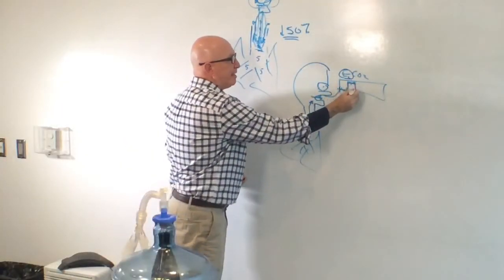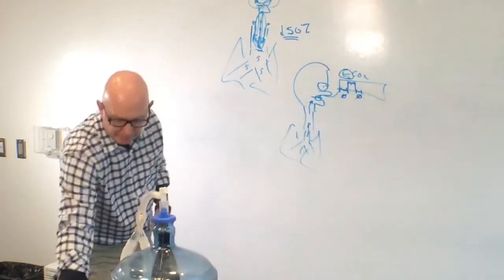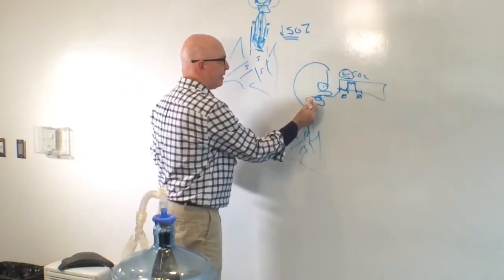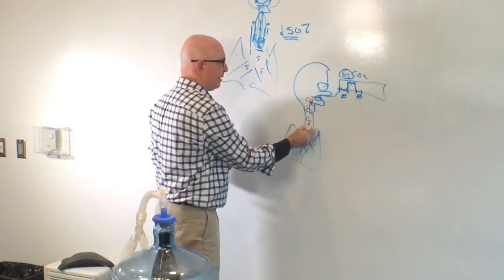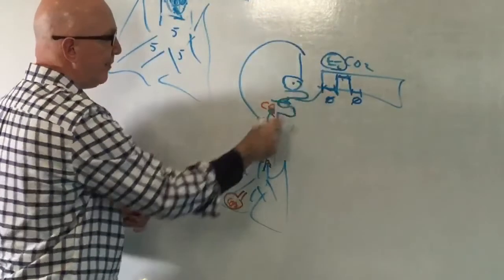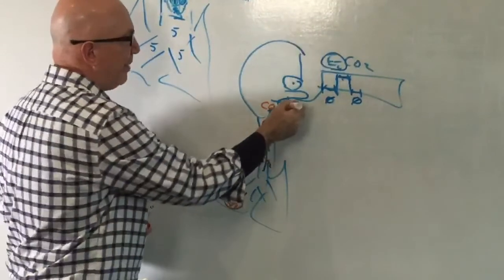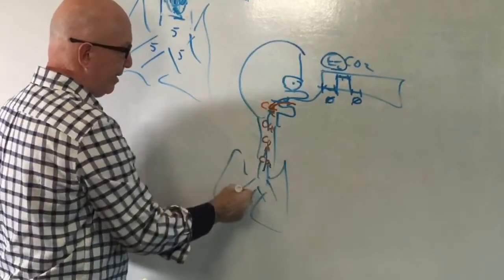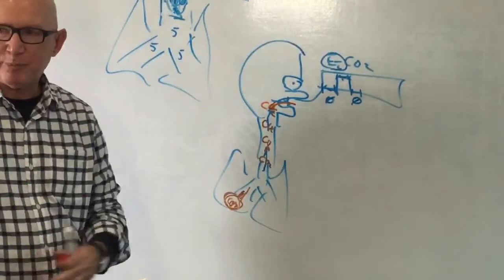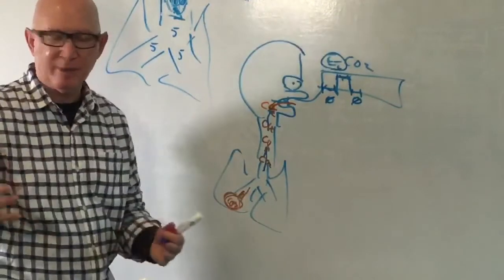The thing that happens then is on inspiration, the CO2 rapidly drops back down to 0 again. As inspiration begins, we have essentially alveolar gas inside our airways. The alveolus had CO2 that it exhaled on the previous breath. So at the end of exhalation, this is alveolar gas inside our conducting airways. When the patient inhales at the beginning of the next inspiration, the gas that goes back to the alveolus is the gas it tried to get rid of on the last breath. So the first bit of gas that gets back to the alveolus is equal to the CO2 that it tried to get rid of on the previous breath.